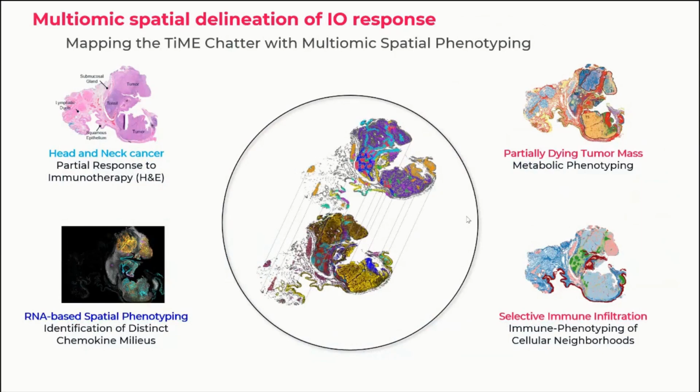And so where we're going with these tissues is we're starting to go from the H&E, the spatial proteomics data, the spatial transcriptomics data, and the neighborhood analyses, and starting to build this omic cloud and then use that data to impute this information into the H&E to identify pathology-interpretable features on the H&E. And that ultimately democratizes spatial for the field. We need to do these higher-plex, multi-omic assays to really figure out what is the underlying signal that is dictating response and resistance to therapy.